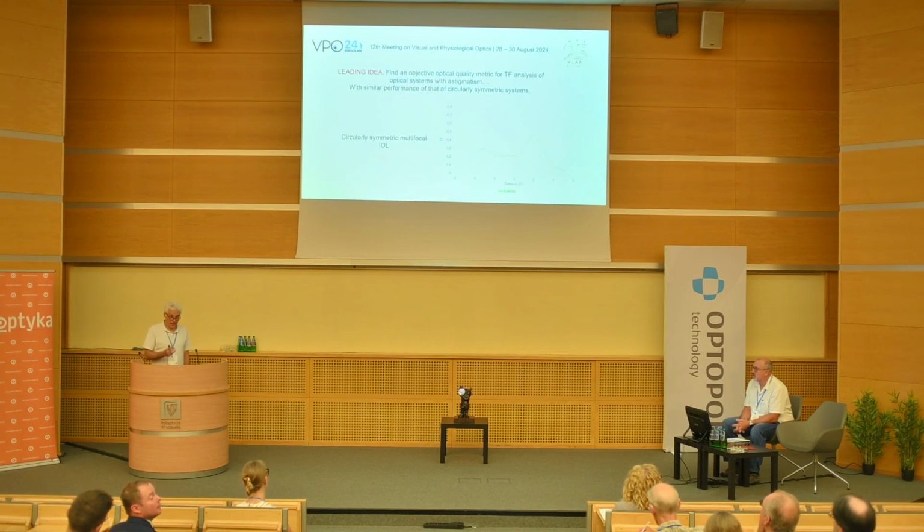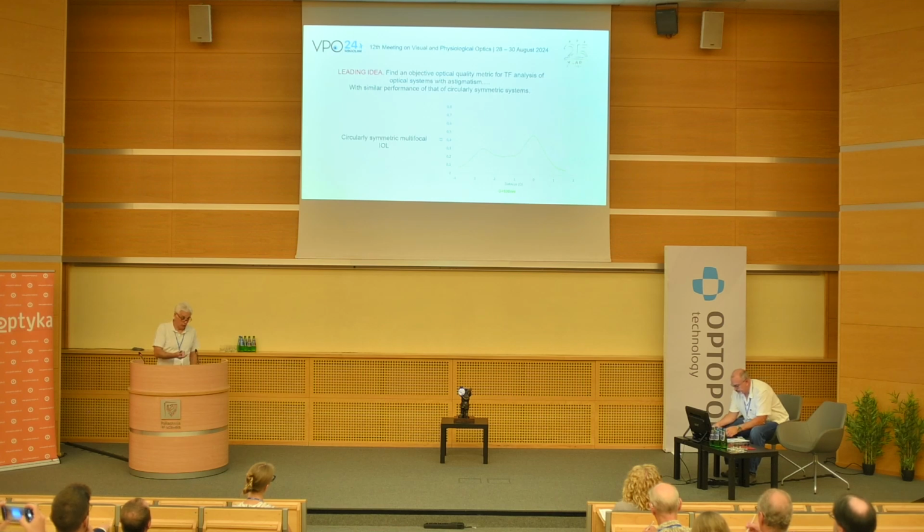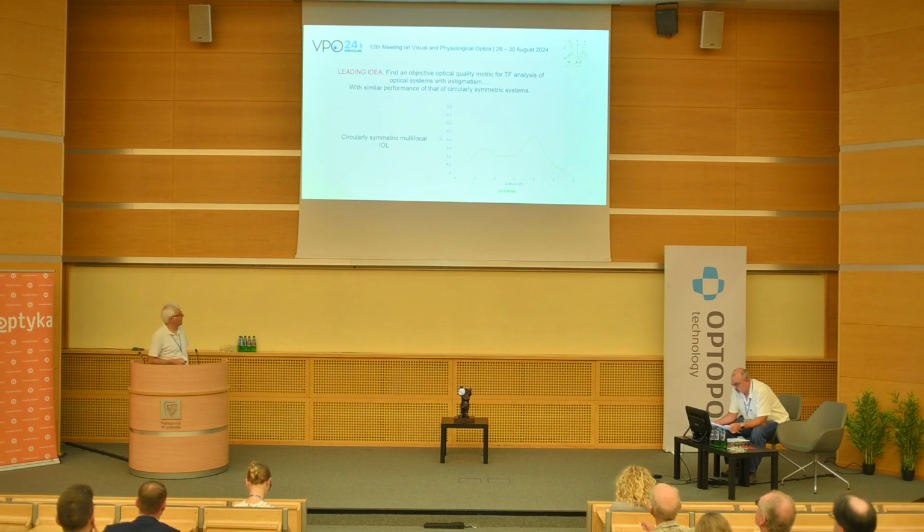Well, what's the leading idea of this talk? We want to find an objective optical quality metric for focus analysis of optical systems with astigmatism. And the condition is similar performance to that of circularly symmetric systems. What do I mean?